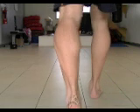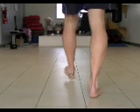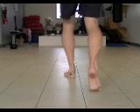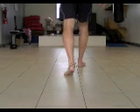Now here we have just one piece of dynamic tape in place. We can see that the heel already starts to shift further laterally after heel off, and the foot is far more vertical with an even distribution at push-off.